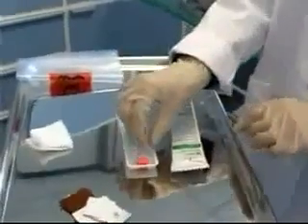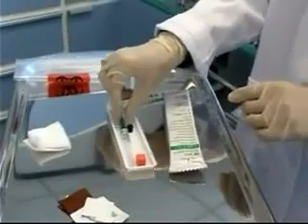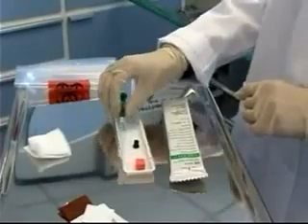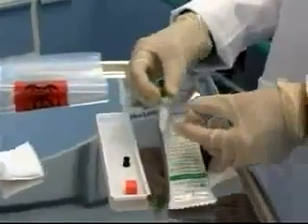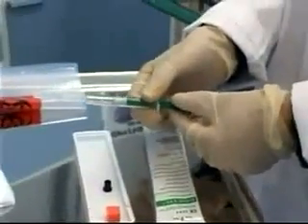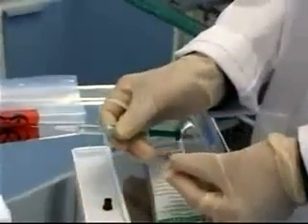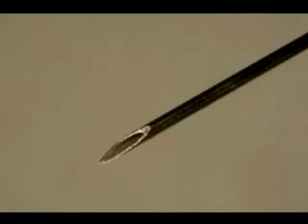While I'm waiting for the skin prep to dry, I can open my blood gas kit. The kit is made up of three different pieces. First is an orange air ball, which I'm going to use to expel any excess air from the syringe. There is a black cap to go over the syringe for transport to the lab. I'm going to pull back slightly on the plunger so that once I've got that needle in the artery, it's going to be able to push back to fill the syringe with the pulsations from the artery. I'm going to slide the cap off of my needle and make sure that I can see the bevel so that I know to go in bevel-up when I insert the needle through the skin.